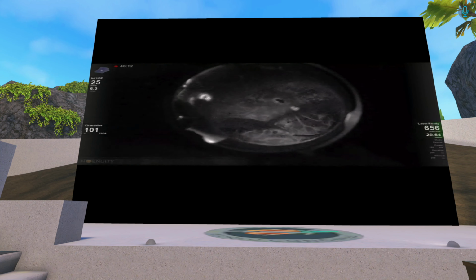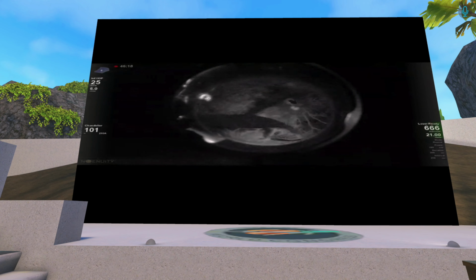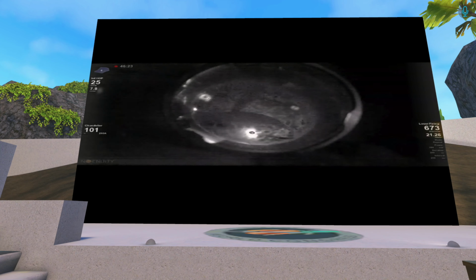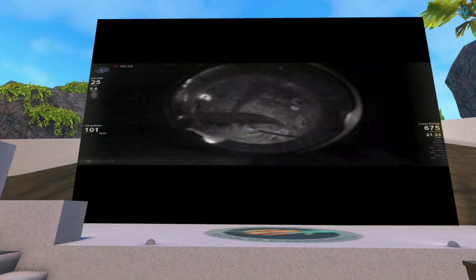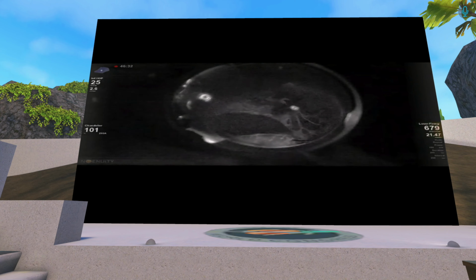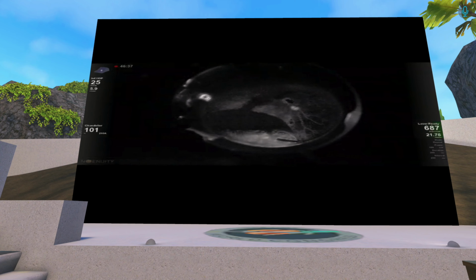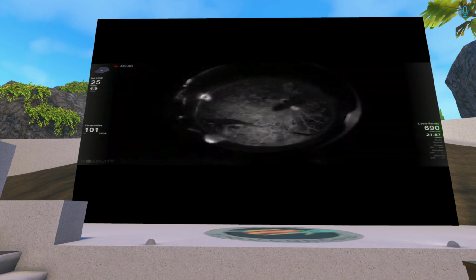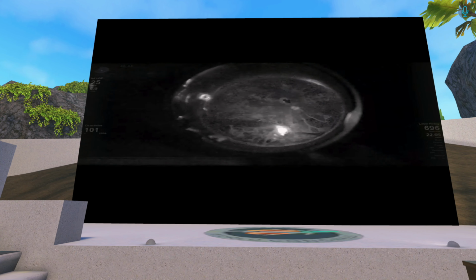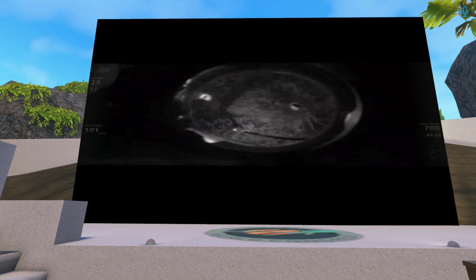So what I've been doing recently is, as you have, treating the areas of ischemic retina, but in the non-ischemic retina I'll just do a very light scatter. Because I have the sense that in some of these patients, their retinopathy won't progress so much because they're post-vitrectomized, but they can become more ischemic. I didn't know if anybody else has seen late post-vitrectomized eyes getting NVG.